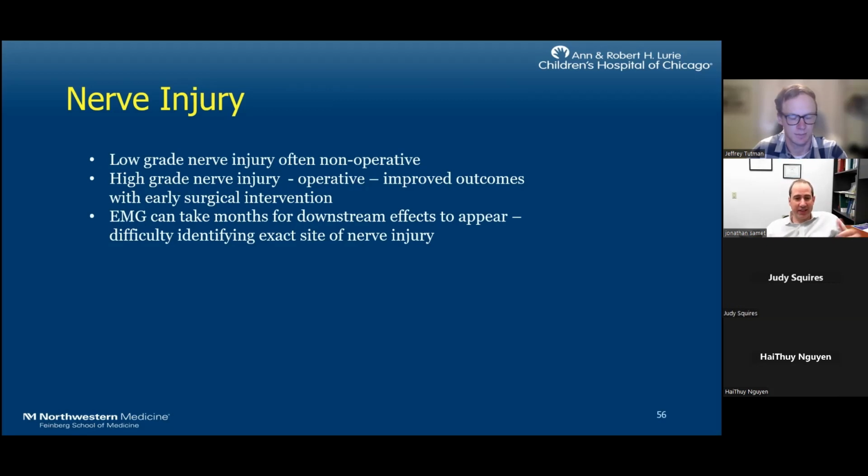One of the first cases that I ever did, the hand surgeon or plastic surgeon called me and said there's no EMG appointment until 3 months down the road. Is there anything else we can do? We can do an ultrasound. I was like, sure, we can try.